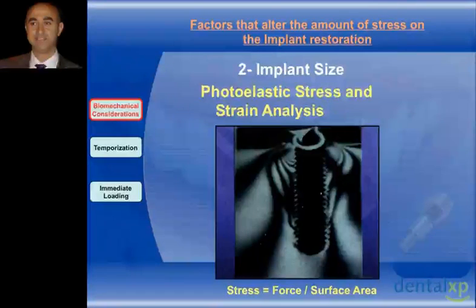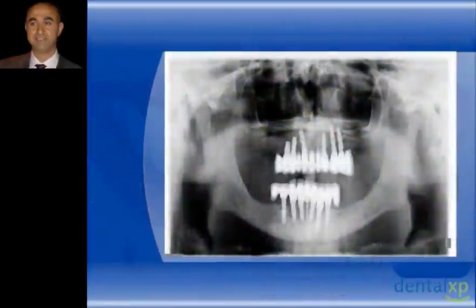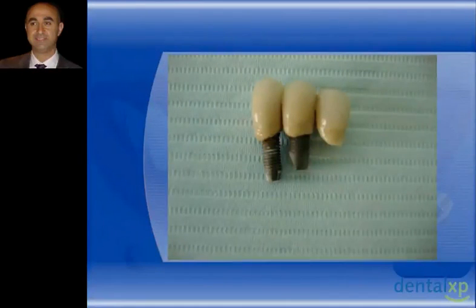The only time that I place longer implants, as everybody knows, is when we're doing immediate extraction and immediate placement of implant, where we are dictated by the length of the socket itself to place a longer implant to get immediate stabilization of the implant in bone itself. Again, other cases where we place implants, cantilevering them, placing shorter implants because there is pneumatization of the sinus and the patient didn't want to do sinus, the doctor doesn't do sinus elevation. What happens at the end, after several years of loading, you can see what happens, failure of the whole restoration itself.